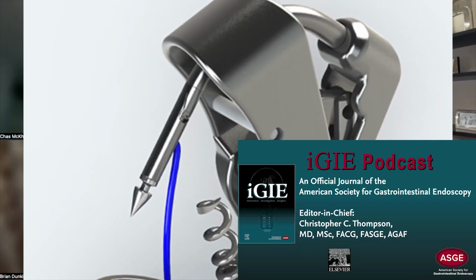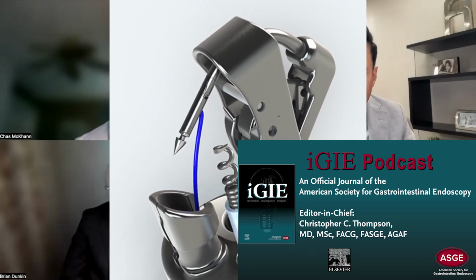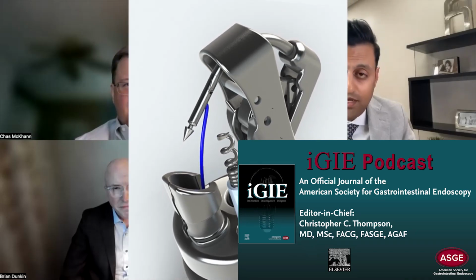And so talk a little bit about that early device. You went from 1.0 to 2.0. What were the things you needed to change from an engineering or device development standpoint to make it what we're utilizing today, which I would say is a very useful device that goes over a double channel scope, for those who have not utilized it. I know that in our interventional practice, we utilize it on a regular basis. Honestly, there are very few days that we're not doing some form of suturing, whether it's suturing stents, suturing perforations, or cerclaging down openings for gastric outlet reduction. There's a myriad of applications we're stumbling upon more and more. But how do you get through that engineering roadblock?